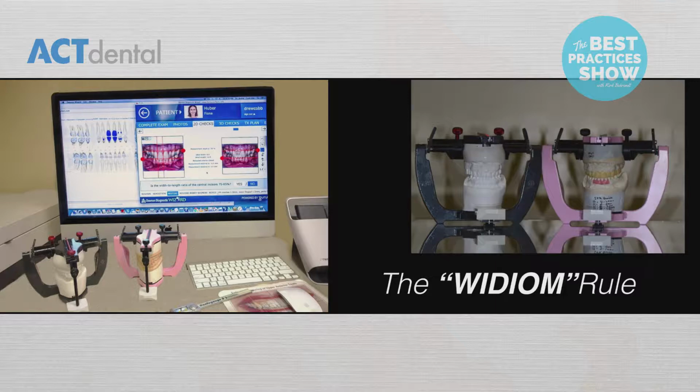You can't do this without that information, because we don't want to guess. The more you guess, the more likely you are to be wrong, and you don't want to be wrong on the definitive restoration day. What I mean by that is the day you put in the final restorations or try them in. We want that to be a predictable day.